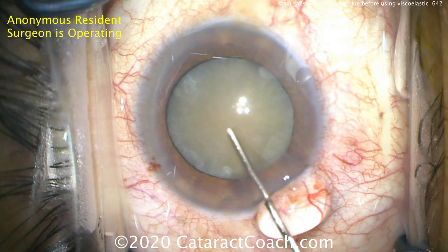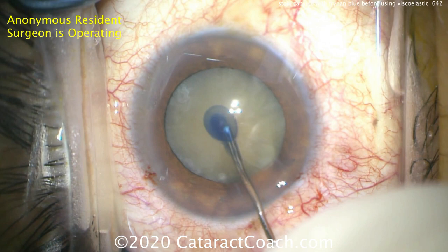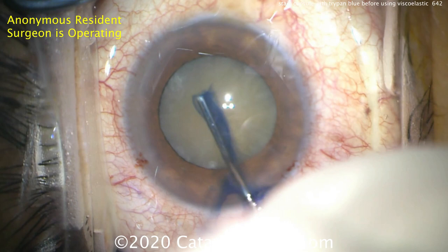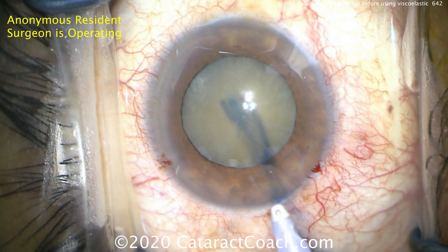Now here's the blue dye. Putting in the TriPan Blue Dye is tough because everything's already coated with the dispersive viscoelastic. When the dye is injected in the eye, it doesn't want to go anywhere — it's trapped within the dispersive viscoelastic. If you put in only a cohesive viscoelastic, you could put a layer of TriPan Blue Dye under it, but even if you try to rub, the whole anterior lens capsule is already coated in viscoelastic. The dye is not going to stick very well. This is not going to work.